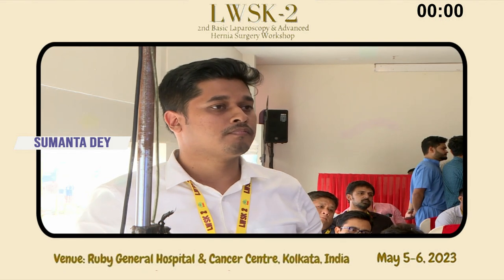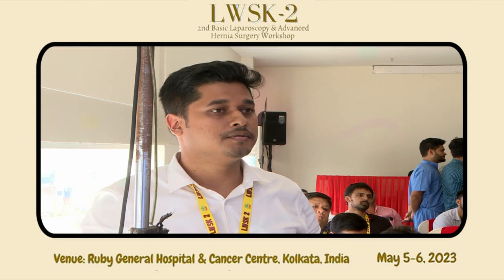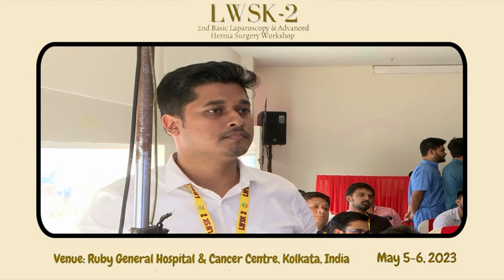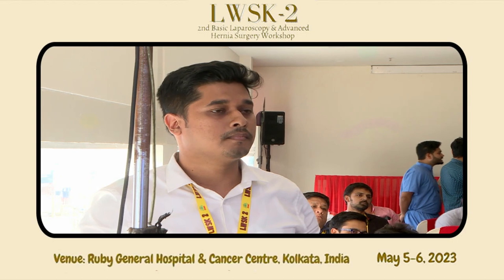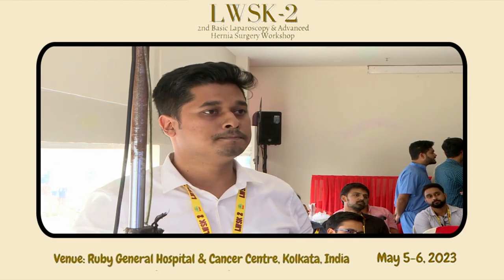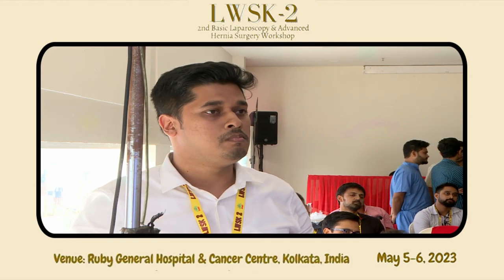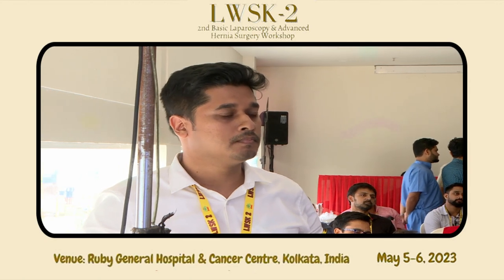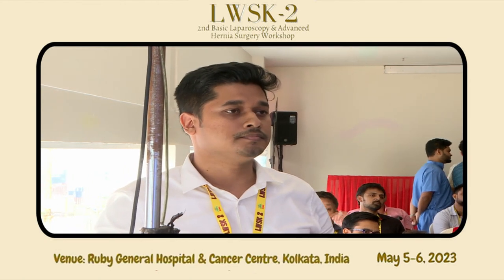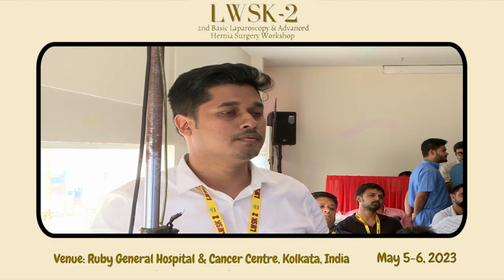It depends upon the quadrant of the abdomen that you are going to inspect. So suppose you have a suspected gallbladder malignancy and you want to see whether it's a metastatic gallbladder or something. So first you do the umbilical port, and then after putting the camera port, you need to see. It's just the way I have shown, the serial inspection of the abdomen. Then suppose you are seeing a nodule on the liver. A gallbladder mass is there along with the nodule on the liver. Then you want to take a biopsy.